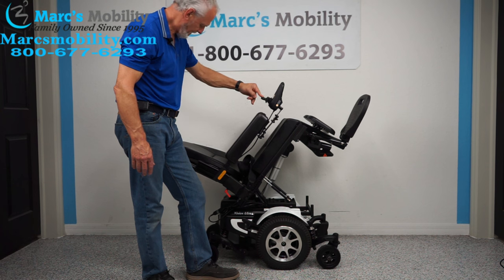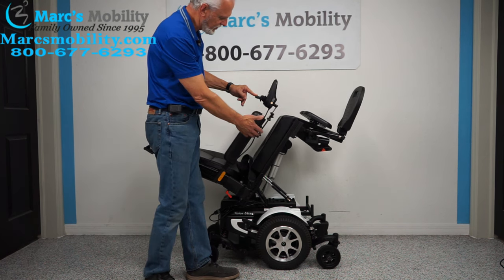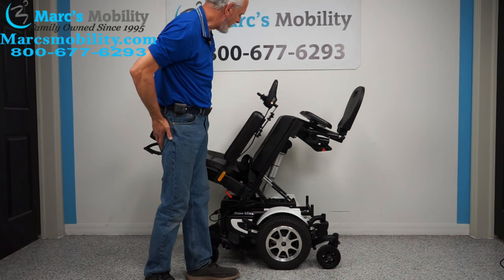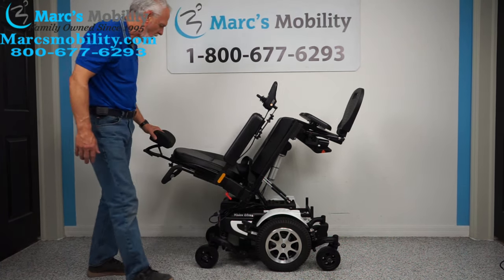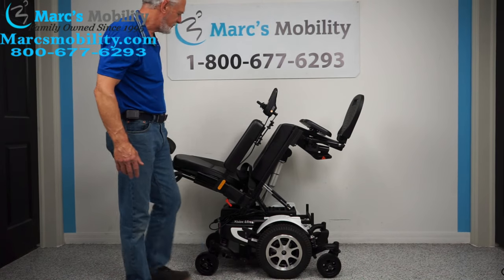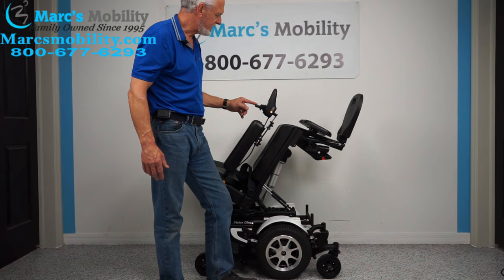It's a pretty good tilt. This is good because if you want to relieve pressure off your bottom, have circulation in your legs, just want to relax, or want to wash someone's hair, it's nice to be tilted this far back. Now I'm going to hit the button on the right side and extend the legs out.